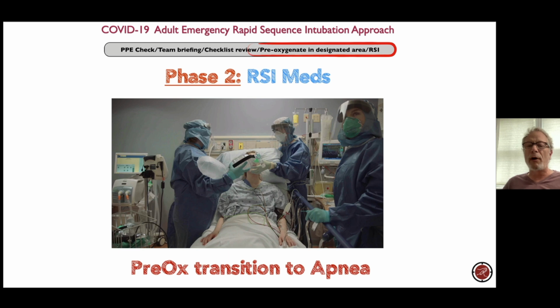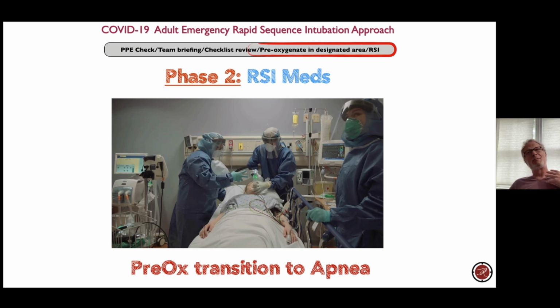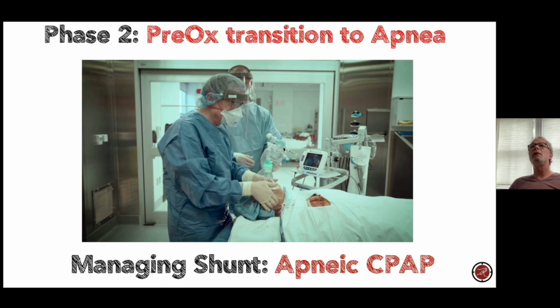We're keeping them upright, and then we're going to take them down to a reverse Trendelenburg position. As their airway collapses, where it was open before, you've got to get behind there and open their airway with a jaw thrust, when they're not supine but in that reverse Trendelenburg, or head up 25 by 25 degrees, and place an OPA. And then what are we going to do? Well, we have to wait before we do laryngoscopy.